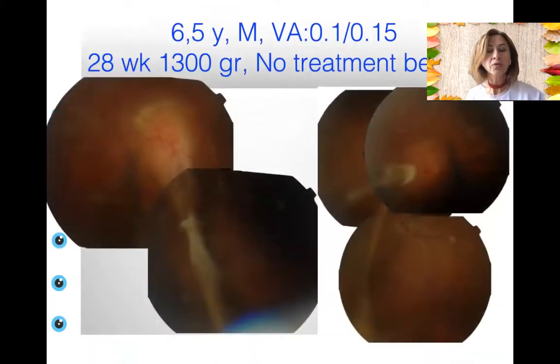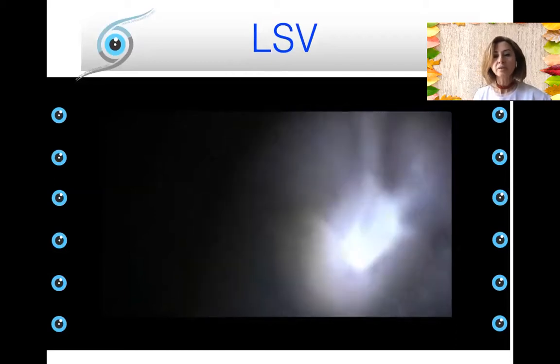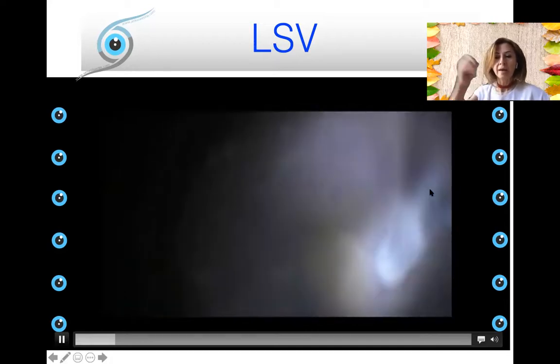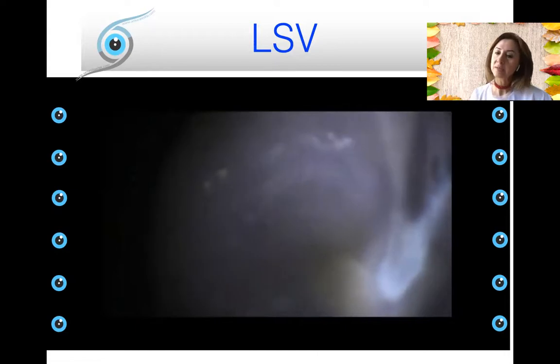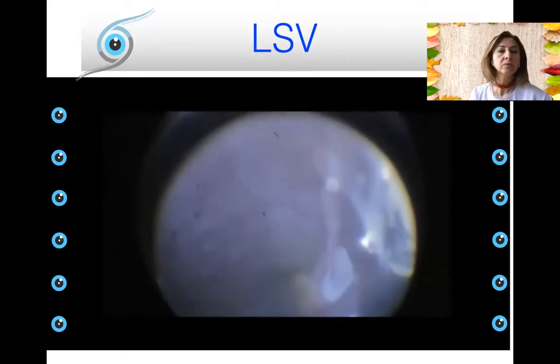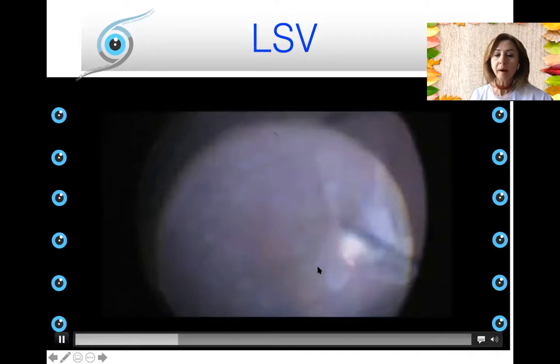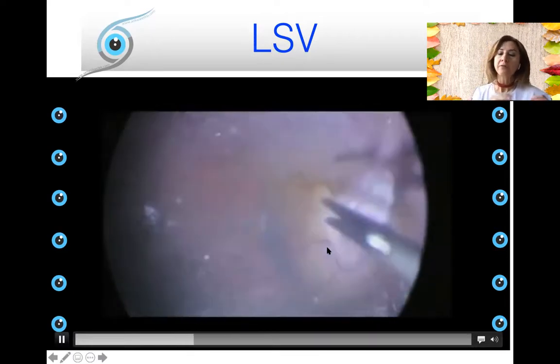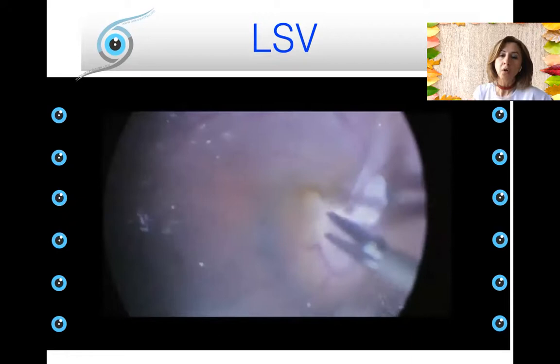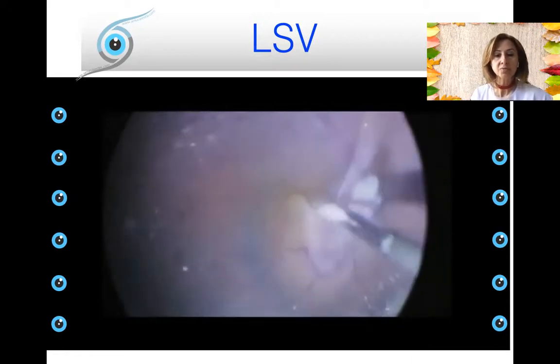So another case, 6.5 years of age, and he had no treatment before. You see a bilateral inferonasally dragged retina, the macula was off, vision was just 0.1. So what we did is just lens-sparing vitrectomy. Although this membrane was going to the back of the lens, it was an anteroposterior traction. We could do lens-sparing vitrectomy, and these anteroposterior tractions could be relieved much better than tangential ones without so much risk. So probably this macula was detached later in life, because when the eye gets bigger, the fibrotic tissue doesn't get bigger, but it pulls more, and then it causes macular detachment later in life.